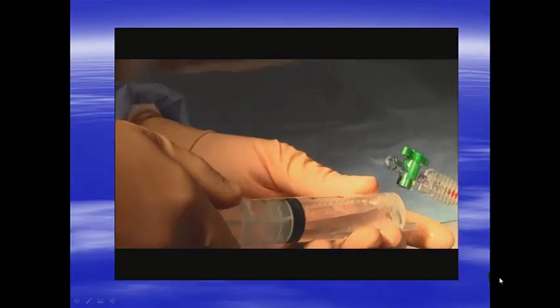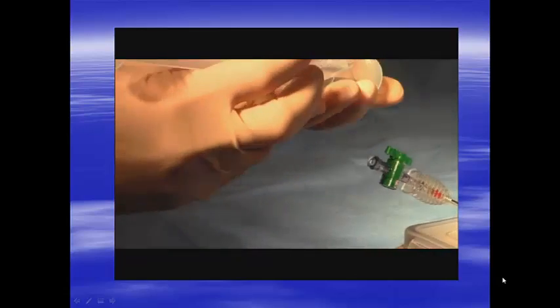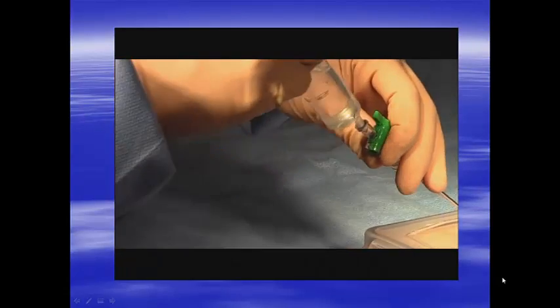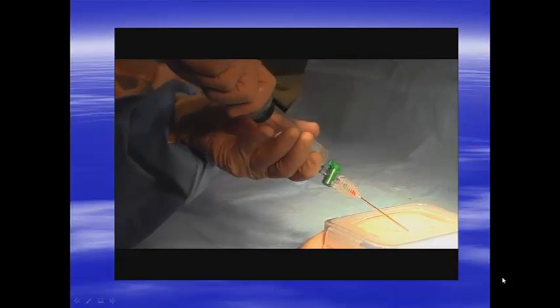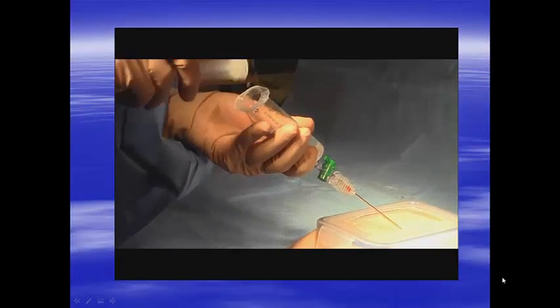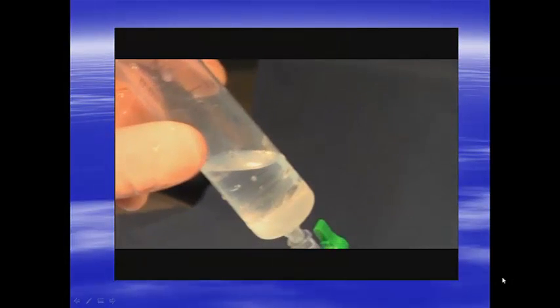The syringe can be removed from the hub of the Veress needle. The plunger is pulled back partially, and the syringe is reinserted to the hub of the needle. The plunger is then removed fully, and we can watch as the normal saline or local anesthetic flows freely into the peritoneal cavity.